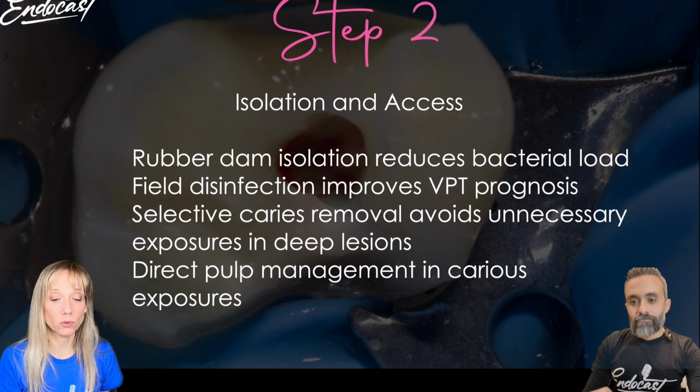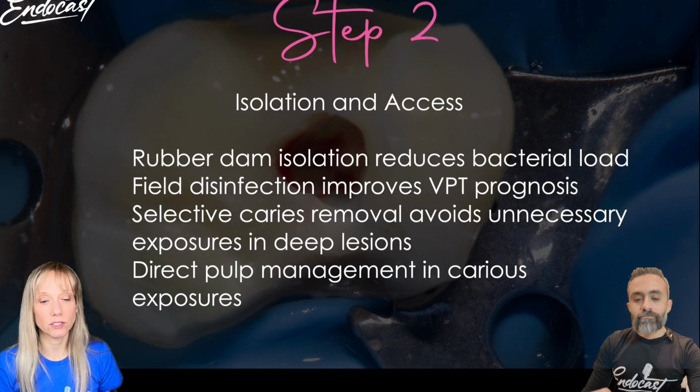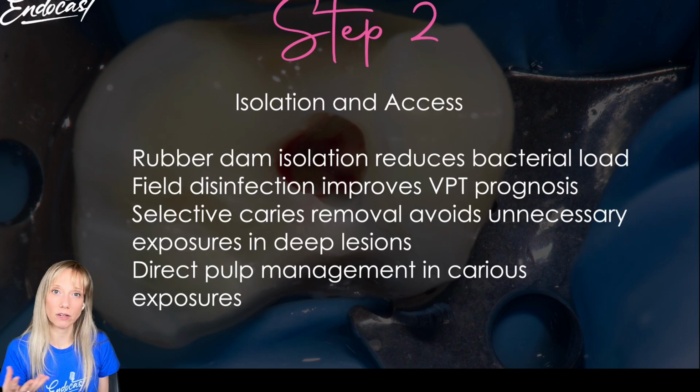And so if you are struggling in placing the rubber dam correctly because maybe the tooth is destroyed and there is some leakage, try to recall all of those small tips and tricks that you can apply to the case in order to improve your isolation.